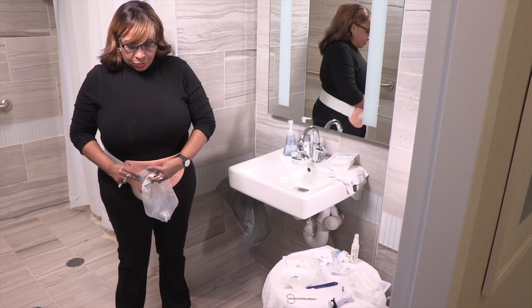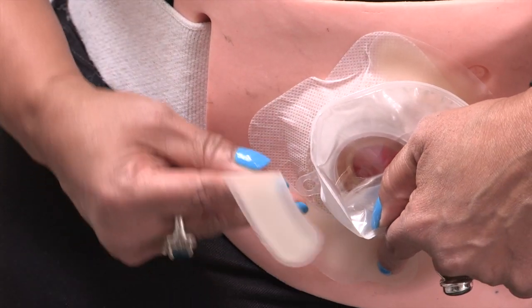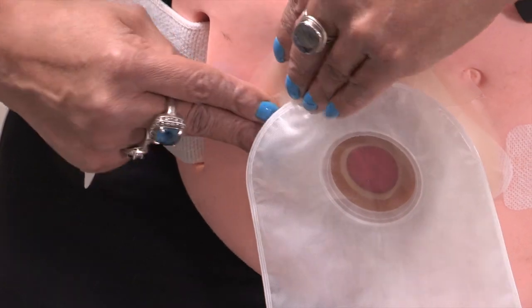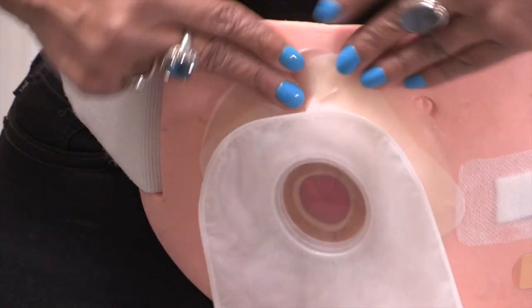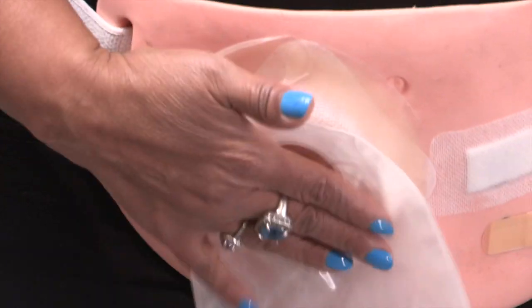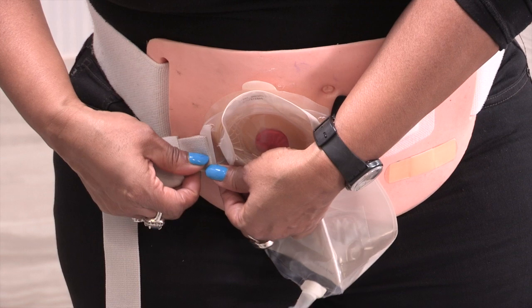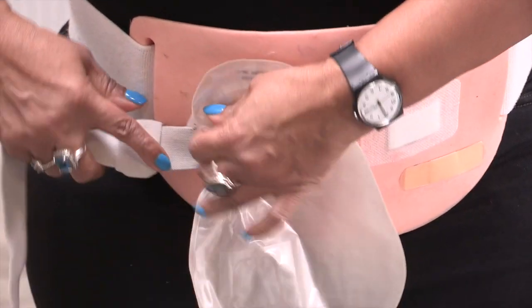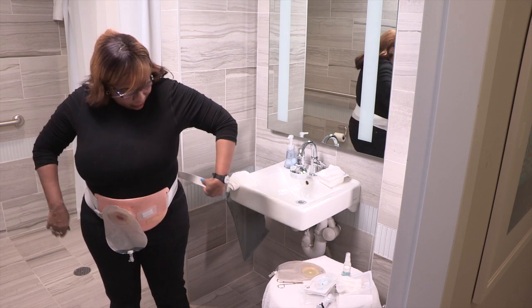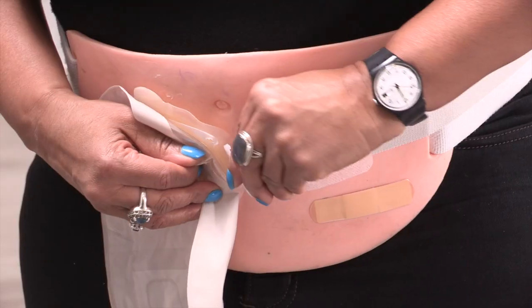If you're using elastic barrier strips, peel the backing from the strips and place them over the wafer, close to the center. It's okay if a small part is on your skin, but try not to have too much on your skin, as this can cause irritation. If you're using a urostomy belt, attach it to the tabs on the pouching system. Hook the belt to one side, wrap it around your waist, then hook it to the other side. Adjust it so it fits snugly.